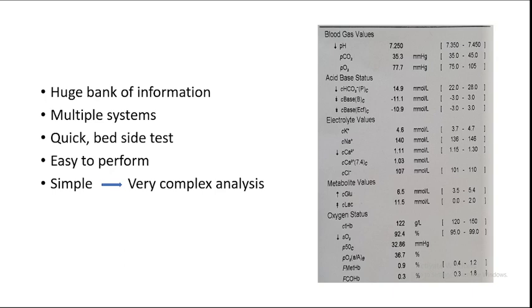And it's a very quick bedside test, very easy to perform. And blood gas analysis is actually simple. But of course, you can go into very complex analysis as well. But I was given the task to tell you how to analyze this in a simple way. So we will be focusing on this.